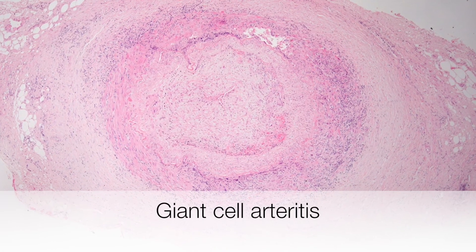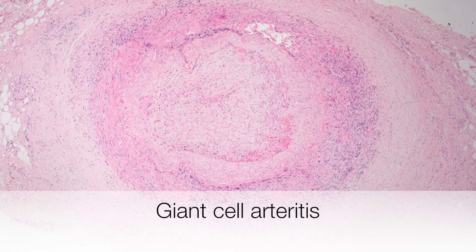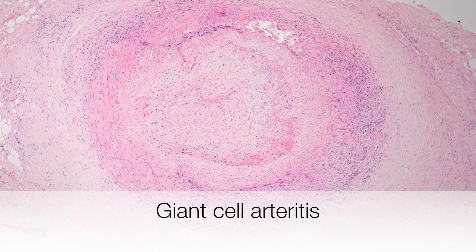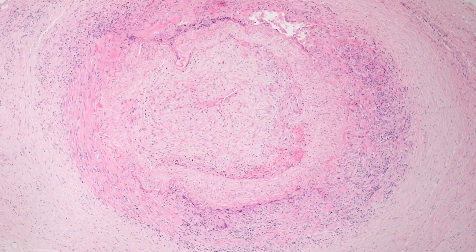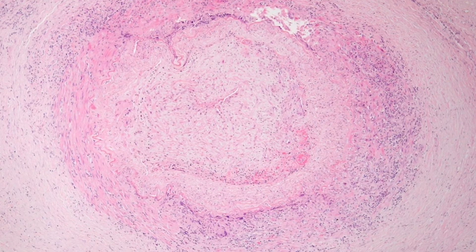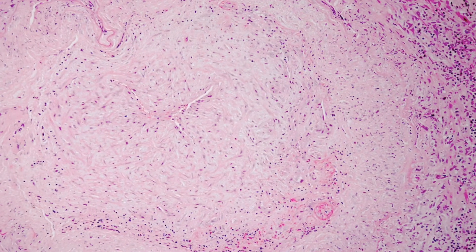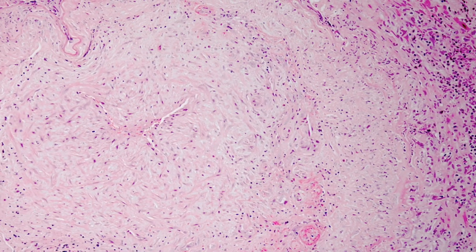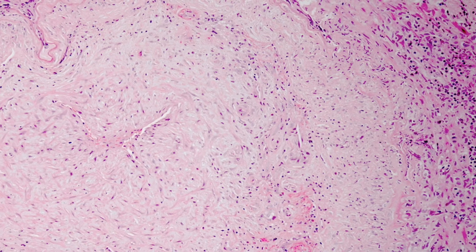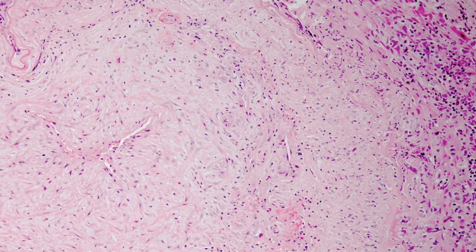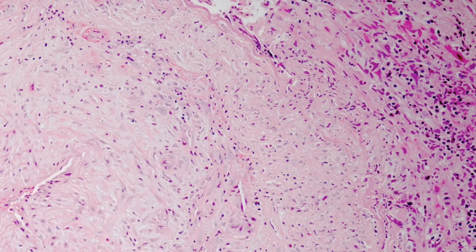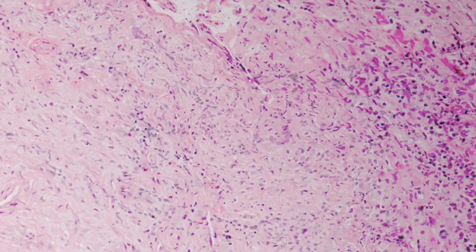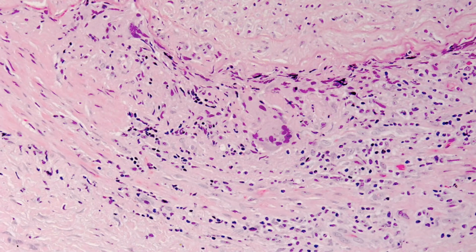In this low power view of the temporal artery biopsy, you can see that the temporal artery lumen is completely occluded. On higher power, you can see that there is a chronic inflammatory infiltrate composed of lymphocytes, histiocytes, and giant cells.